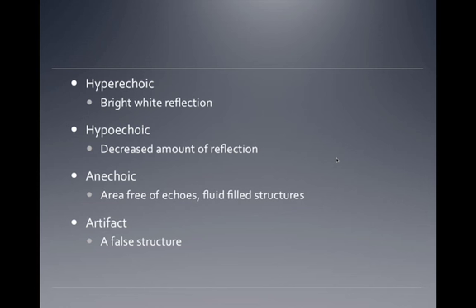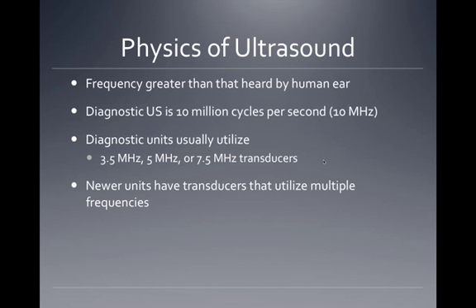And there are all kinds of different things that you can see, and that's why, as far as image interpretation goes, it takes someone who's had a bit of training and experience in order to actually interpret the images.